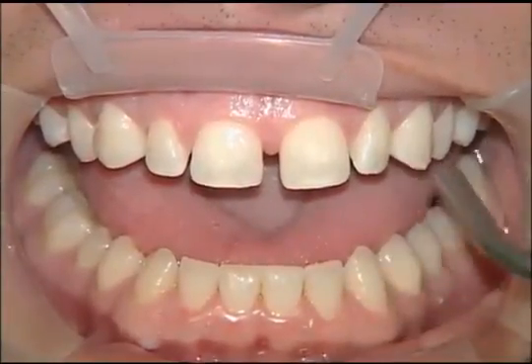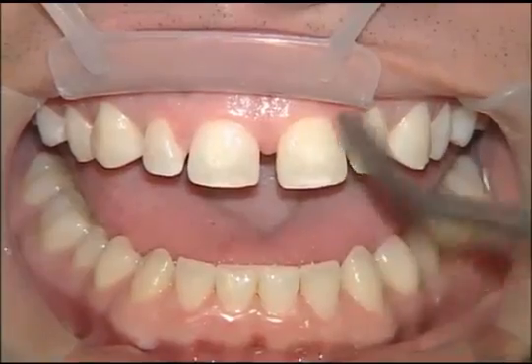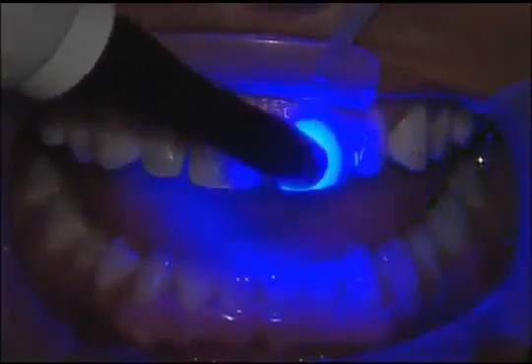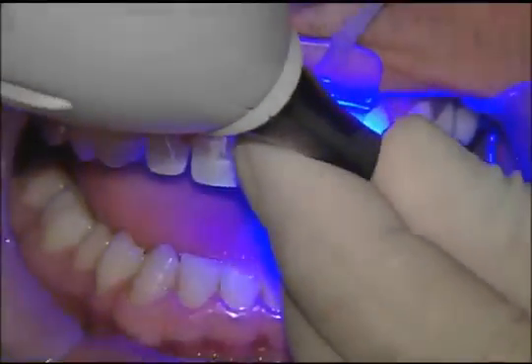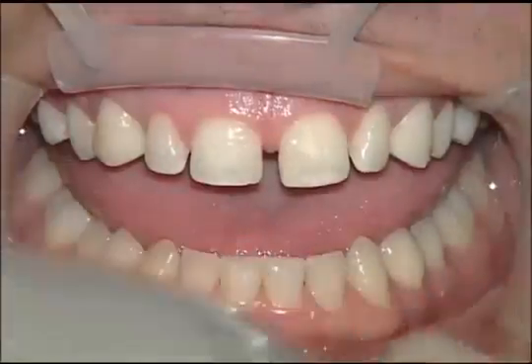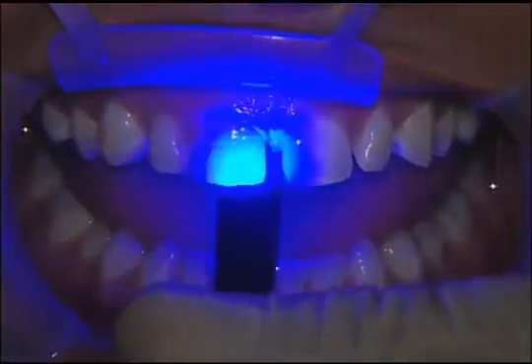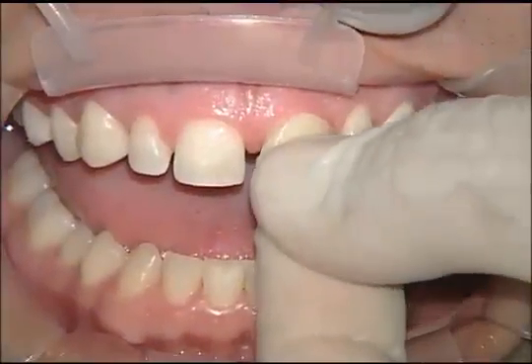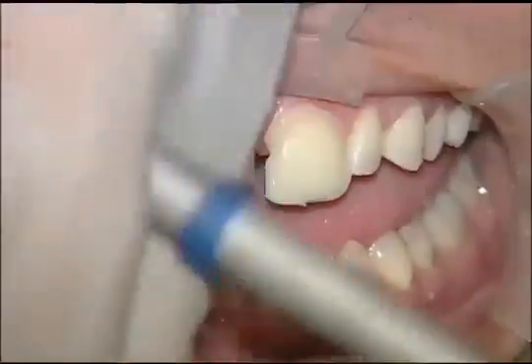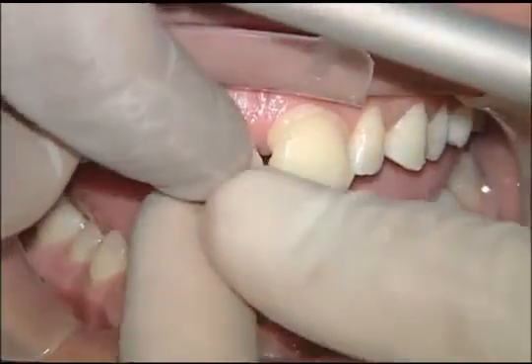This really isn't as big of a problem as it is with prep veneers, because there's nowhere in the preparation for it to pool and keep the veneer from seating. Once we've air thinned that pretty thin, we're going to go ahead and cure that. Depending on the thickness of your veneers, you could wait and cure it once the veneer and the cement are in place, and that's perfectly acceptable as well. But having tried on these veneers already, I know I'm going to be able to put that adhesive on, cure it, and go forward.